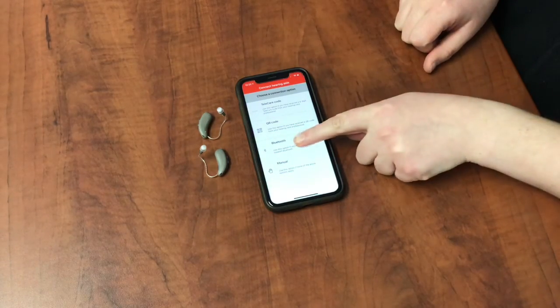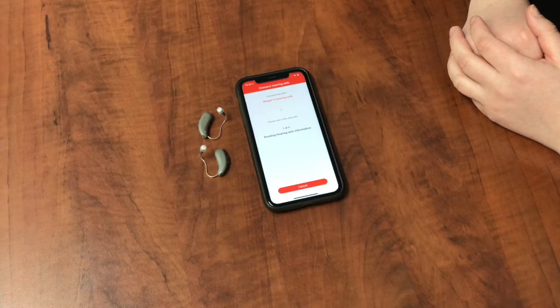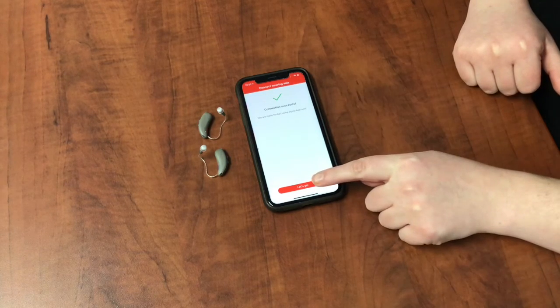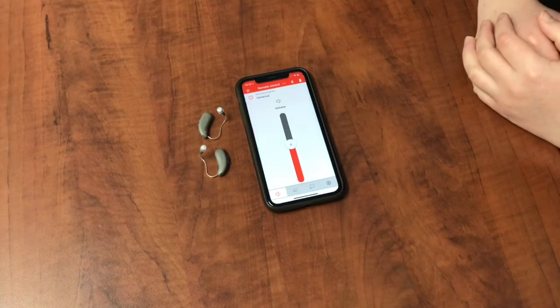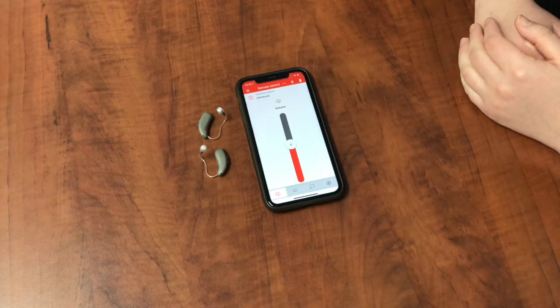Choose the Bluetooth option and it's going to start searching for your hearing aids. Once it's completely loaded, you'll get a green check mark — hit Let's Go. This is what the screen will look like when your hearing aids are connected to the app.